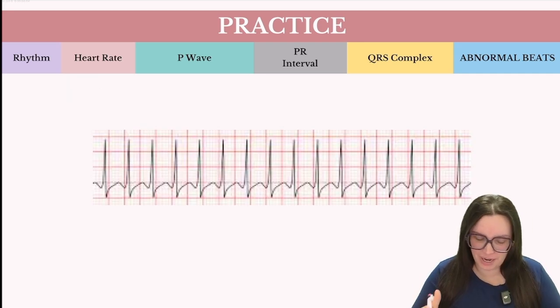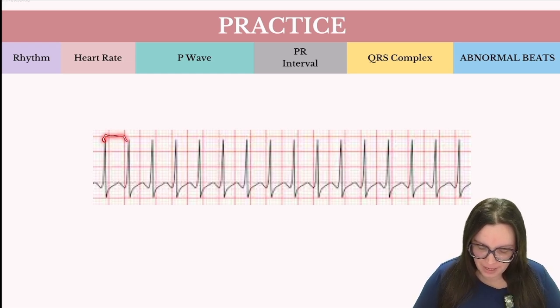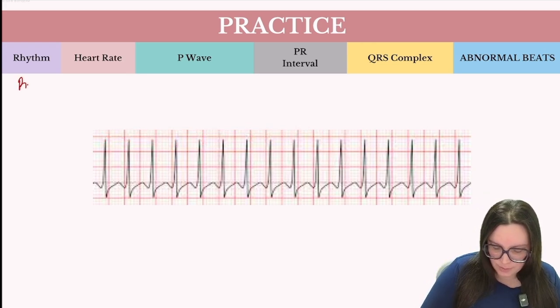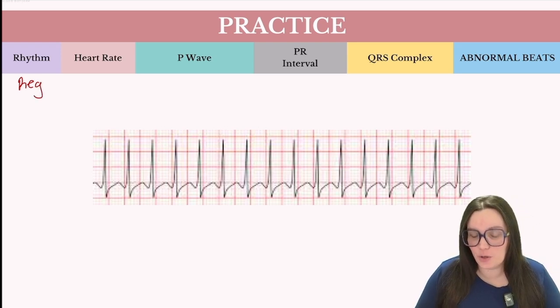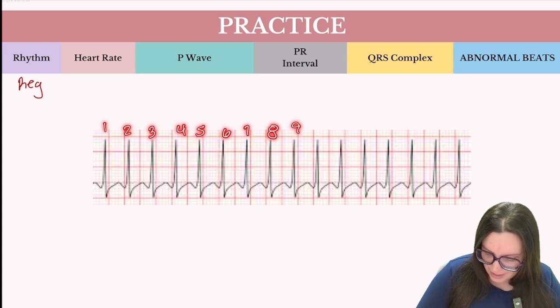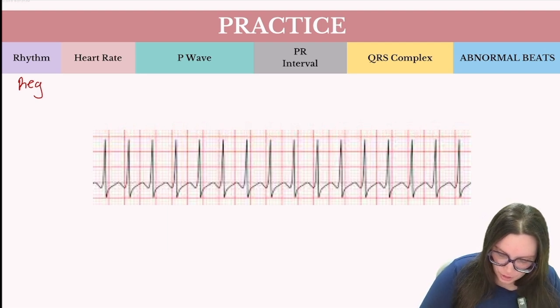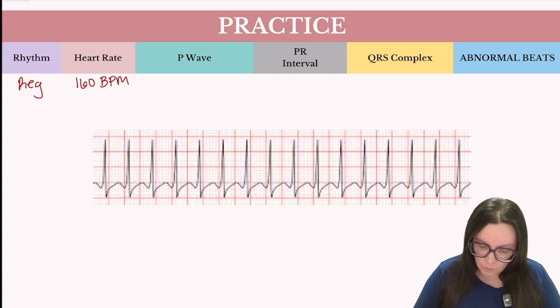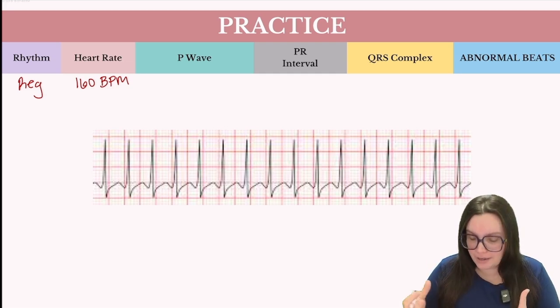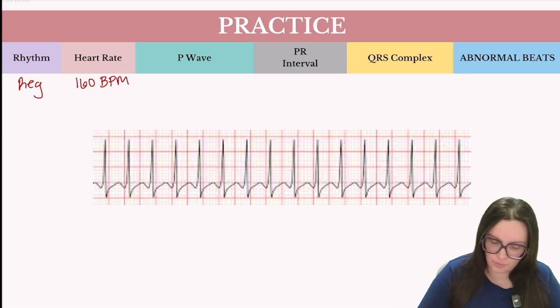Let's take a look at our last practice question. Starting by identifying our rhythm — is it regular or irregular? Based on what I'm seeing, the QRS complex always falls in the same place, so we can call this rhythm regular. Counting QRS complexes: 1, 2, 3, 4, 5, 6, 7, 8, 9, 10, 11, 12, 13, 14, 15, 16 — approximately 160 beats per minute. The ventricular rate is so fast that we're not going to be able to see distinguishable P waves, so no P waves are present.